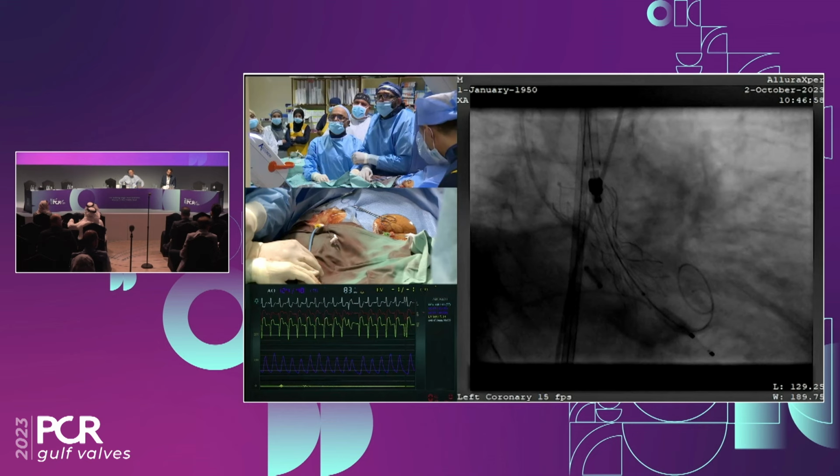This is a very large cell valve, which indicates that we're going to have coronary access, but at the same time we lose from the radial force of the valve itself.